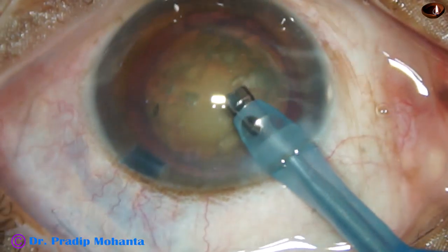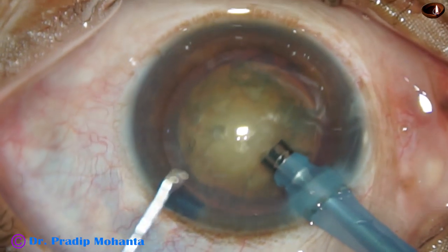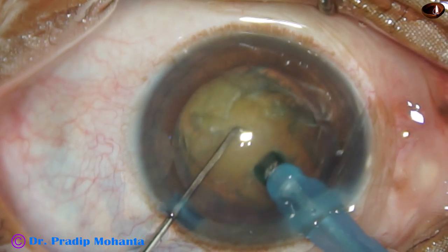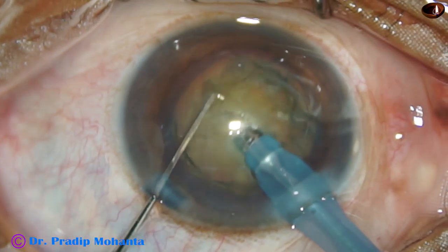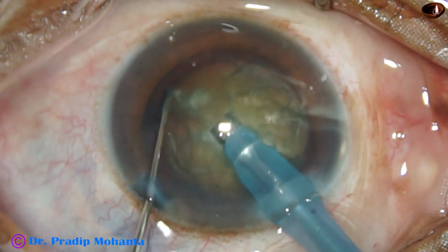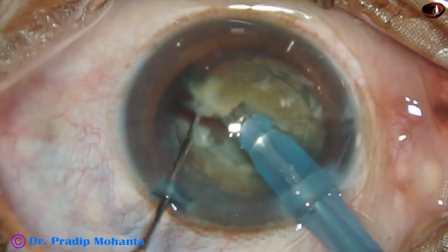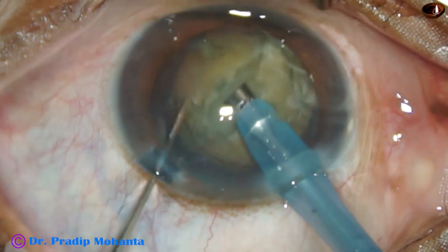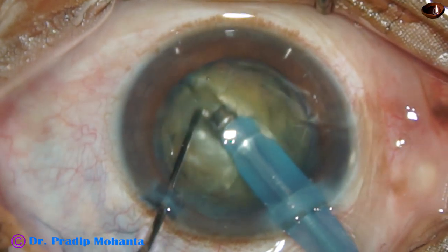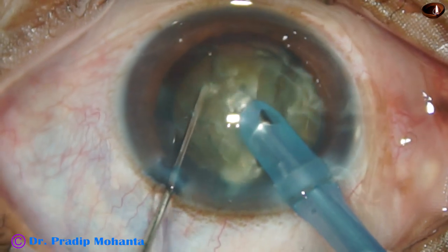Some superficial cortical lens matter is removed. The nucleus is rotated nicely. Now the tip is buried into the substance of the nucleus, goes through the nucleus for a distance, and the nucleus is held very firmly and chopped. The nucleus is rotated 180 degrees and the two hemi-nuclei are completely separated. I call this technique the submarine chop.